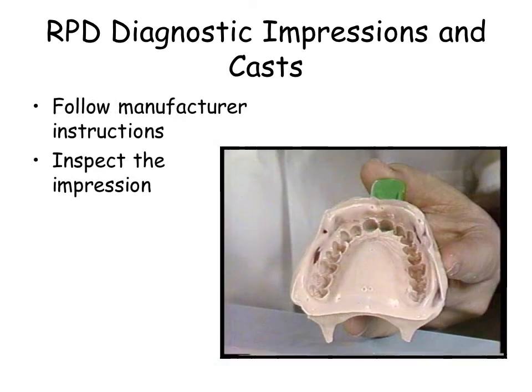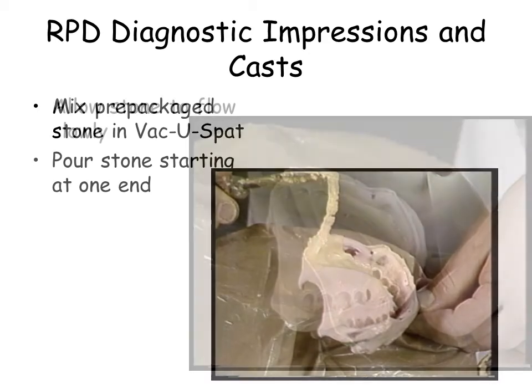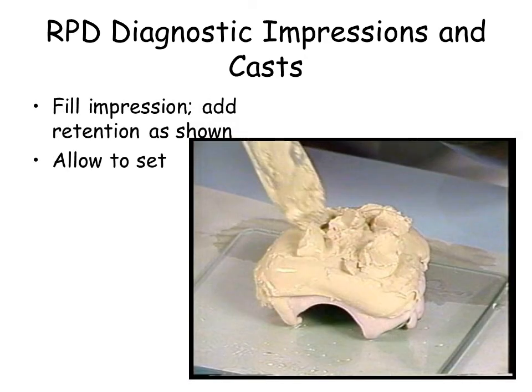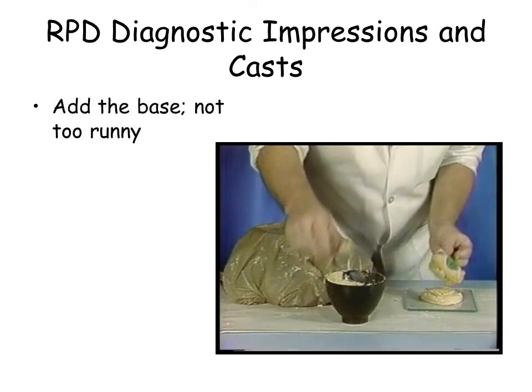Remove the tray in one motion. Observe the impression for defects. Use the double pour method to fabricate diagnostic casts with yellow stone. Trim the base of the cast. The cast is 14 to 16 millimeters thick, and the occlusal plane is level with the bench top. It is not necessary to index the casts at this time.